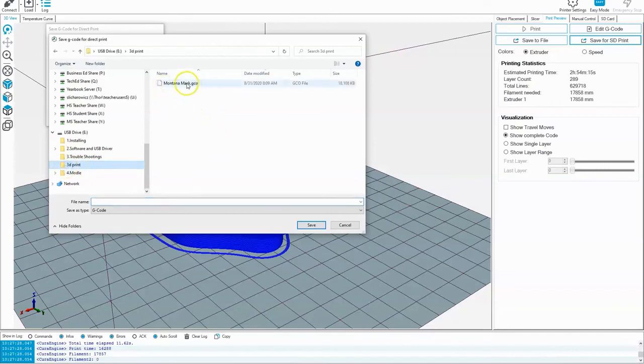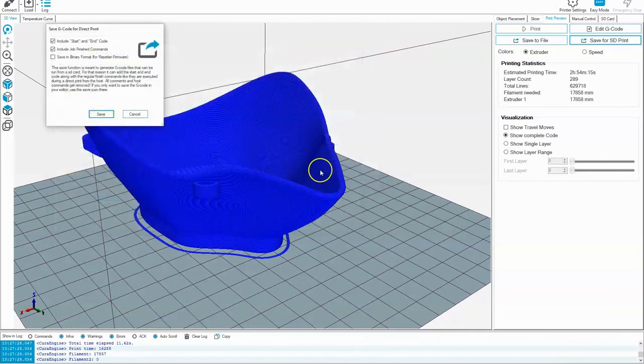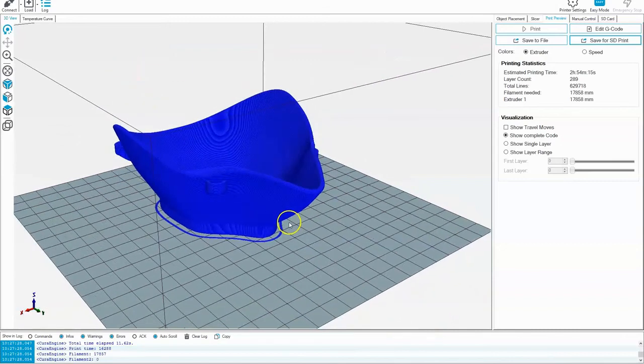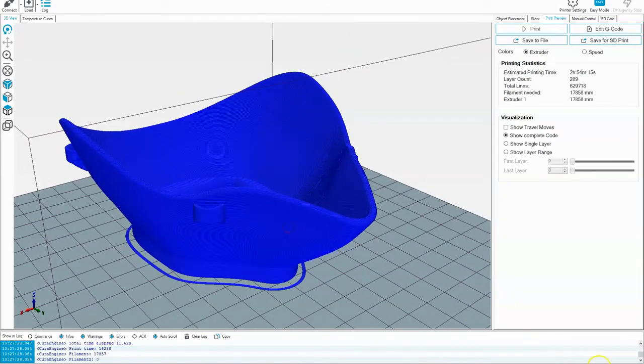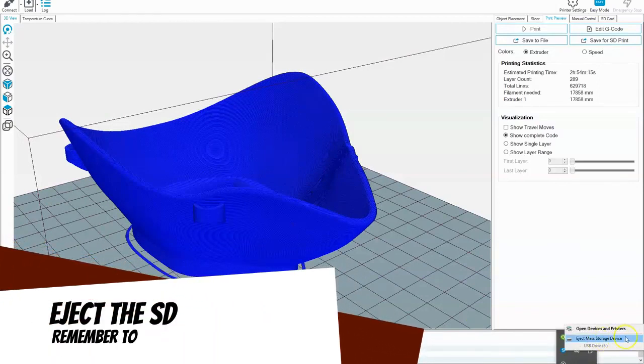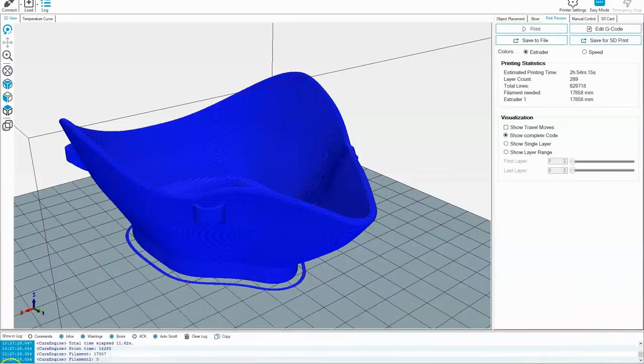Now, here I've already done this once before. You can see that there is the Montana mask. So I'm just going to click on that Montana mask and set it up as if I've just typed it in here, and then I'm going to hit Save. Now it says, do you want to replace it? Absolutely. Go ahead. And now that has been replaced on the SD card. So now we'll go ahead and work our way over to the 3D printer. But first, I'm going to want to eject that mass storage device, that's that micro SD card. So we'll hit eject, and then it'll be ready to take out of the computer.